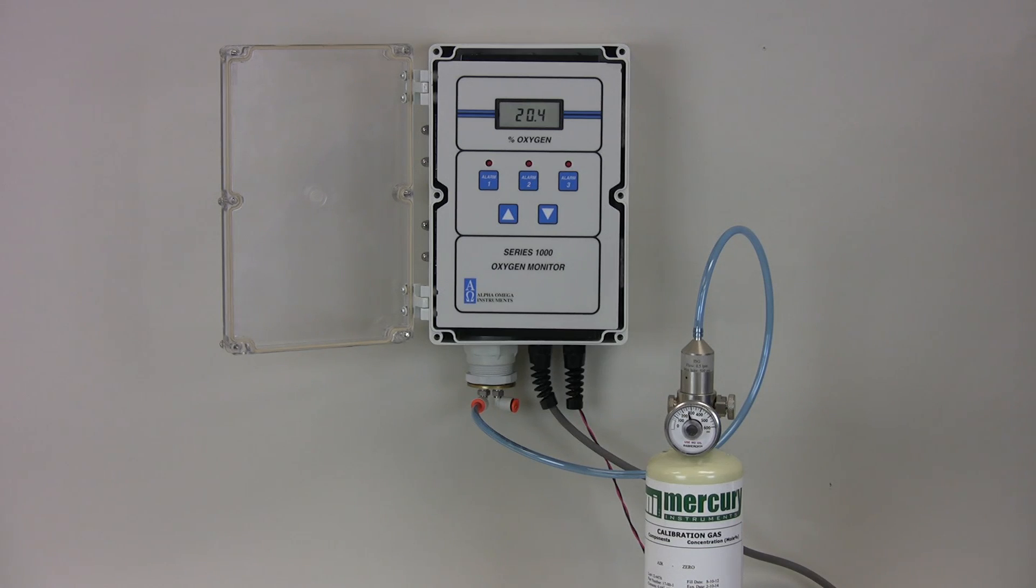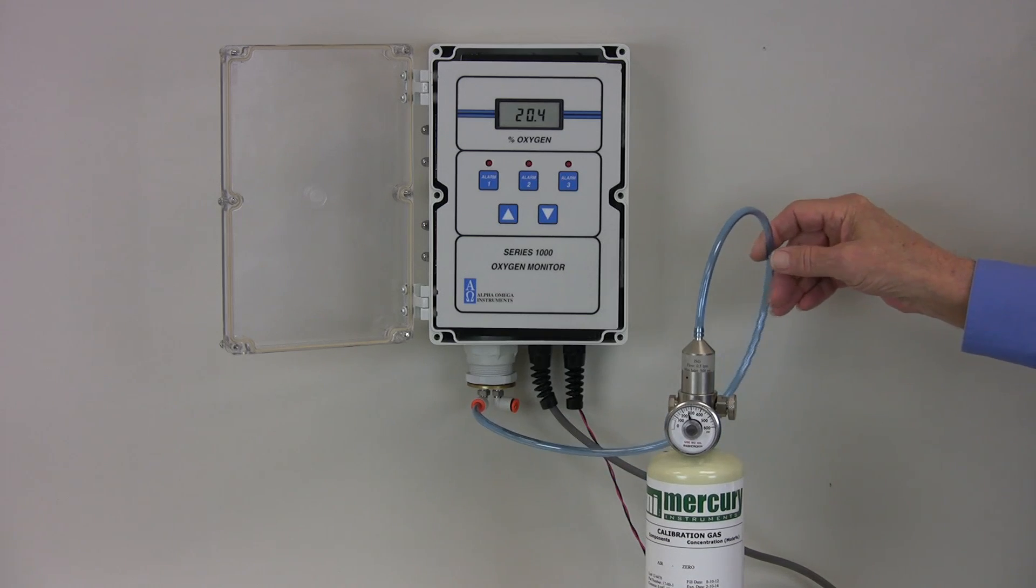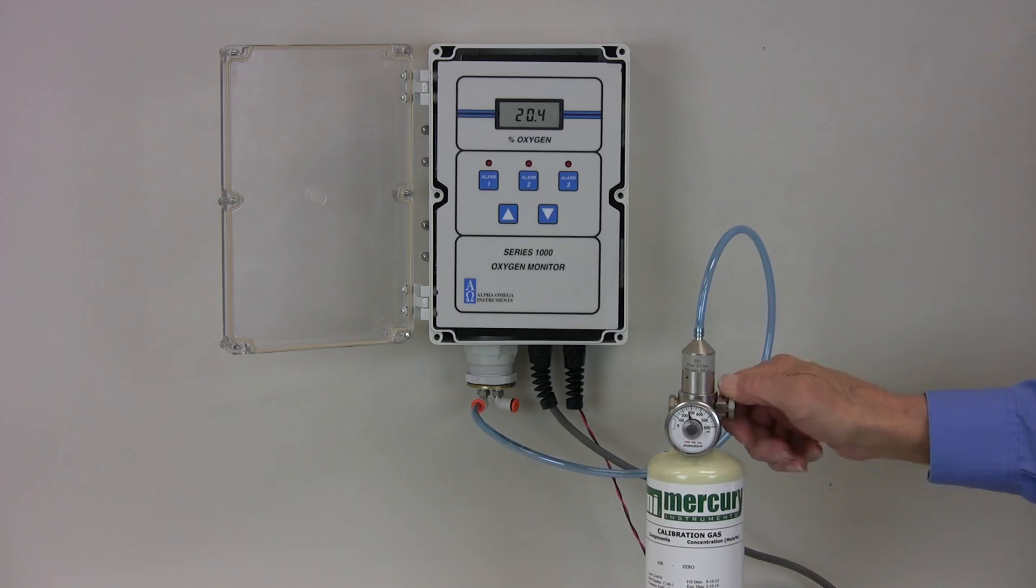As seen here, we have already connected the fixture's inlet to the cylinder of clean, compressed air. Open the tank valve to allow the compressed air to flow through the tube and aspirate the sensor.